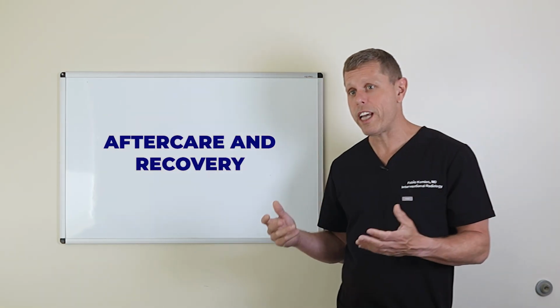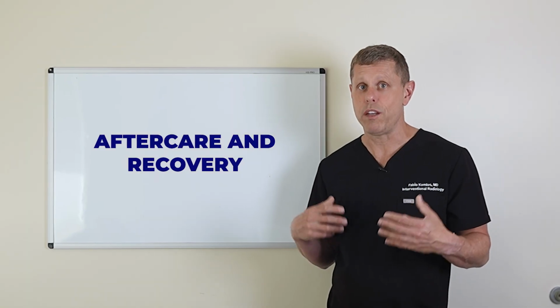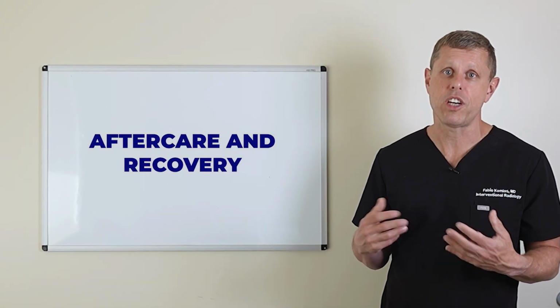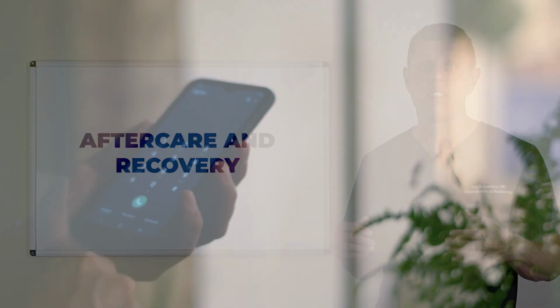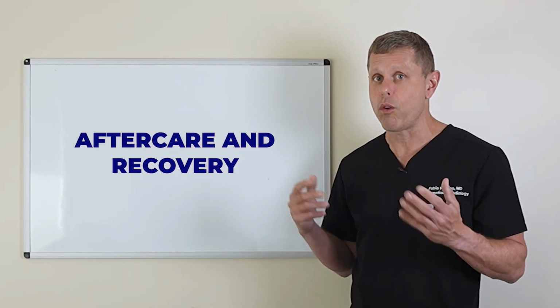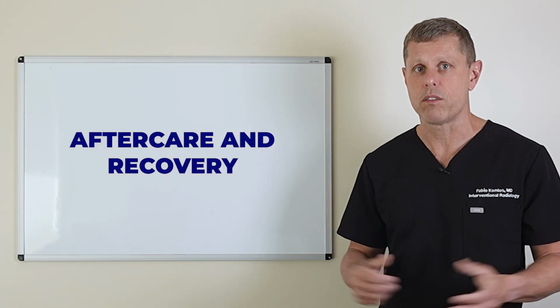It's important to look at the site every day or every few days to make sure that it's not getting red and there is no purulent discharge coming off the site, because if you have any of those, you have to let us know, since you want to make sure to treat it quickly before things get worse and you may develop sepsis or something like that.